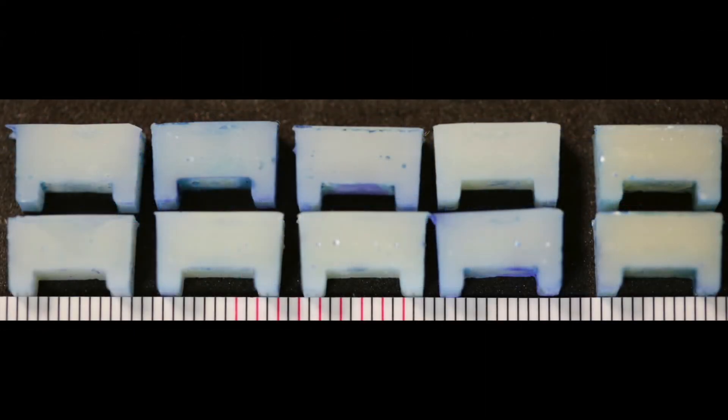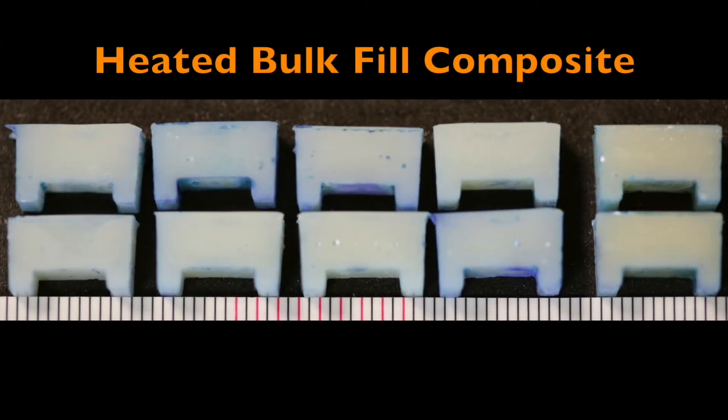An even better way to reduce the knit lines in a composite resin is to bulk fill and bulk cure the material. This works even better if the material has been preheated.